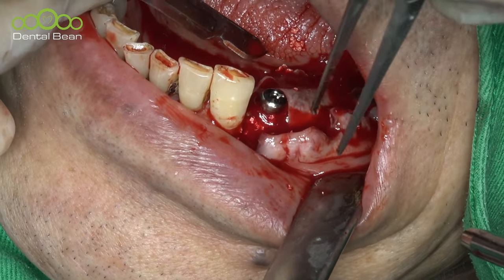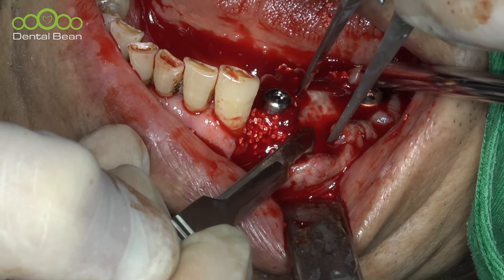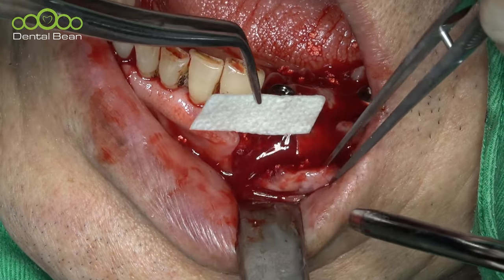Finally, I want to combine the open membrane technique here. So this is the collagen membrane. The resorption rate is usually 6 weeks. It's okay. Okay, I will cover here.